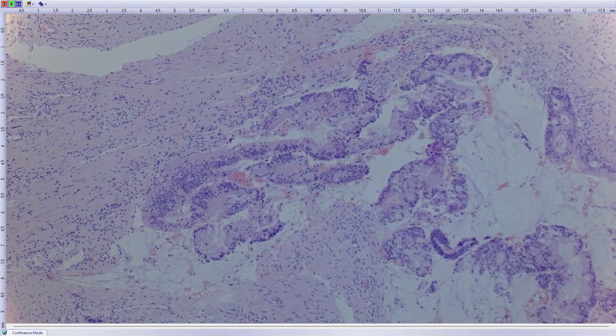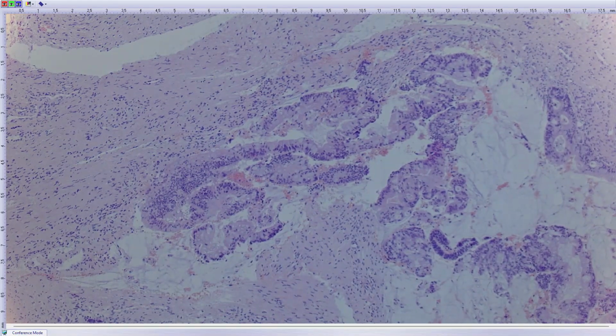I didn't do that, but yes, there is a possibility this could be a mucinous tumor metastasizing. You are right that another option is a mucinous tumor metastasizing into the teratoma. As for this girl, I suggested this possibility in the conclusion of the biopsy, but the girl was 20 years old, so I also told them that it is not very probable, but before they assess this tumor as a primary, they have to exclude the possibility of metastasis.